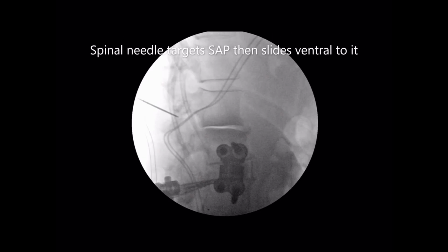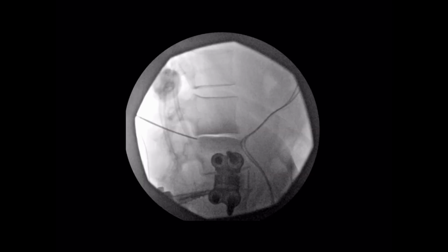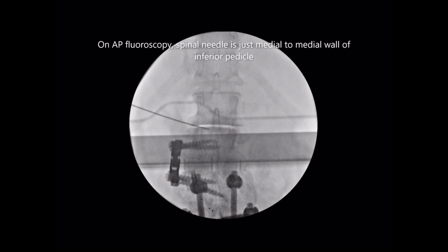Again, similar to the prior case, using a spinal needle to assist with the approach, targeting the SAP and then sliding ventrally. We can advance the needle until it lands on the superior corner of the L2 vertebrae. Next, we can confirm our placement with an AP radiograph. This should show the needle medial to the medial wall of the L2, the inferior level of this surgery.